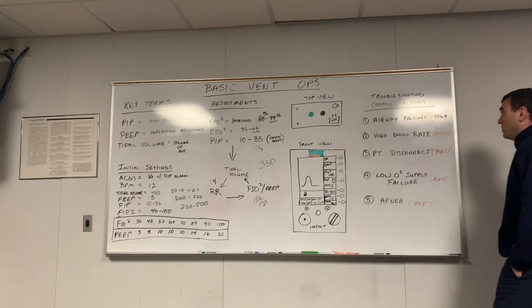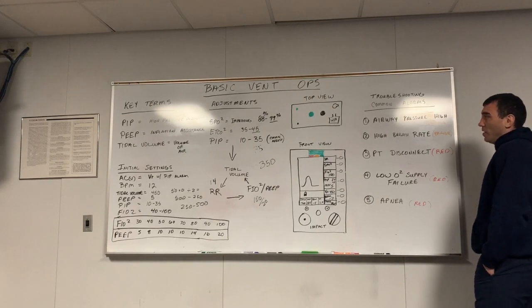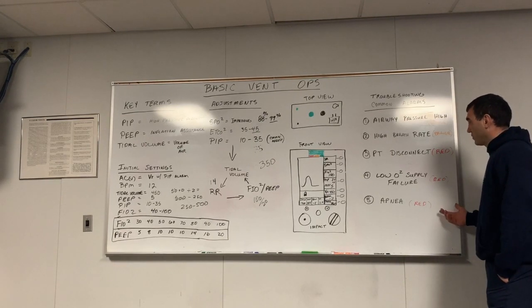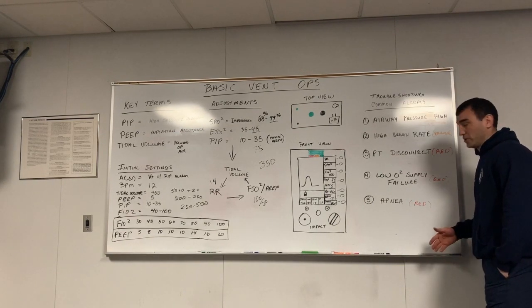Last one, troubleshooting common alarms. Besides adjusting your settings, this would be the most common question that I get personally about vents. You get a lot of calls, people, I ran this call and I had this alarm and I couldn't make it stop.